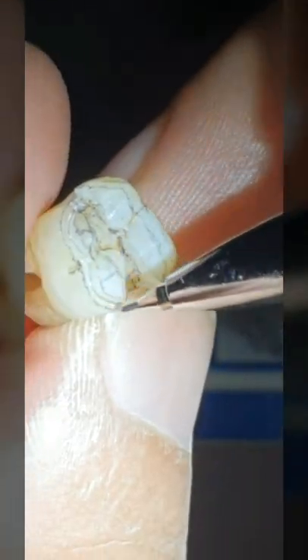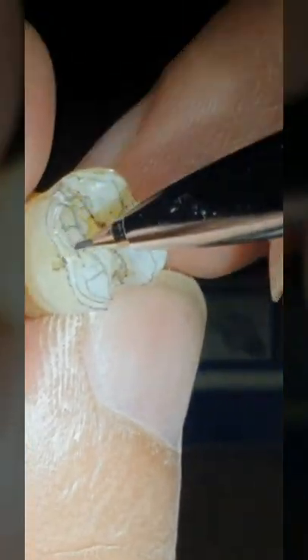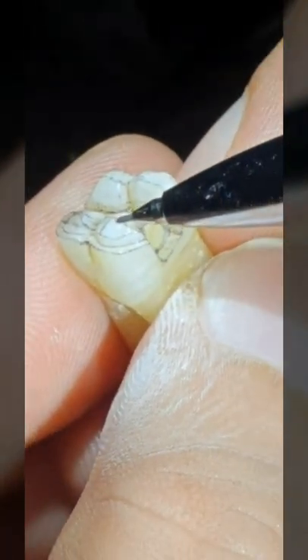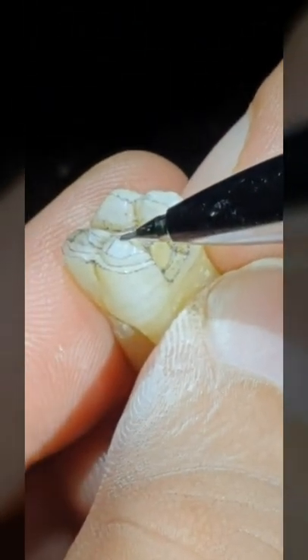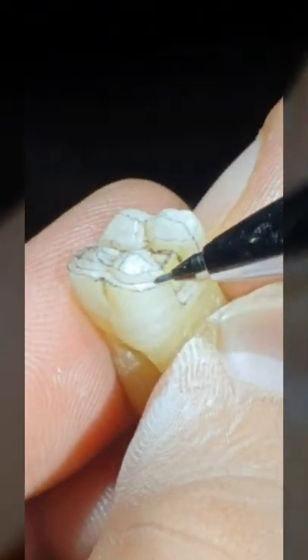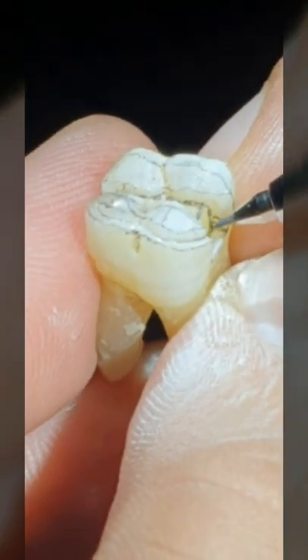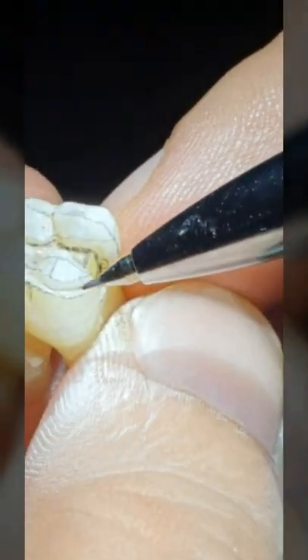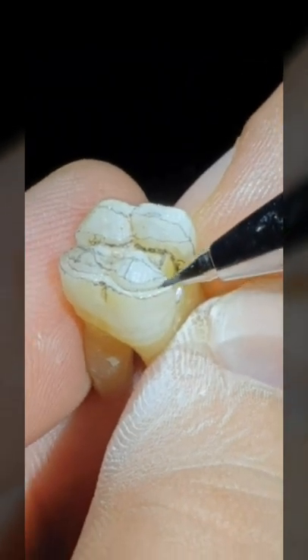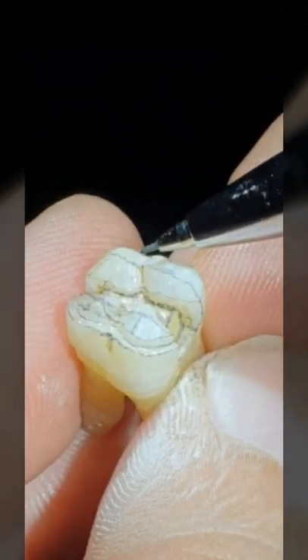So here on the facial and the functional aspect of this tooth, I have put a crown margin, but within about a couple of millimeters of the prepared cusp tip. So 1 millimeter of the cusp tip height and 1 millimeter of wall, and that's where the margin goes. So if I were to do a metal one compared to a porcelain or ceramic or zirconia one, I would do this kind of prep also on the lingual, so I'm going to modify it.